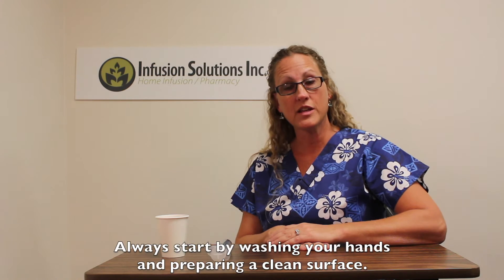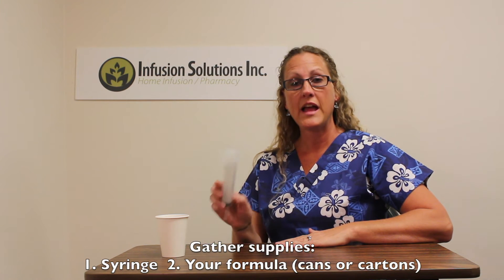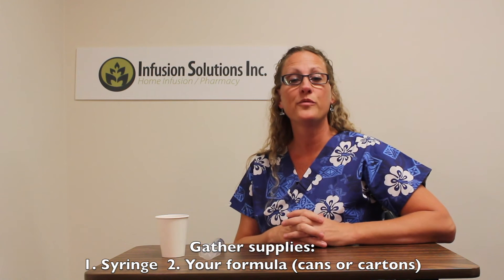When you start your bolus feeding, you'll make sure your hands are clean and you have a clean working surface. You'll have your supplies, which will be your syringe and your tube feed. The tube feed will either come in a can or in a carton.